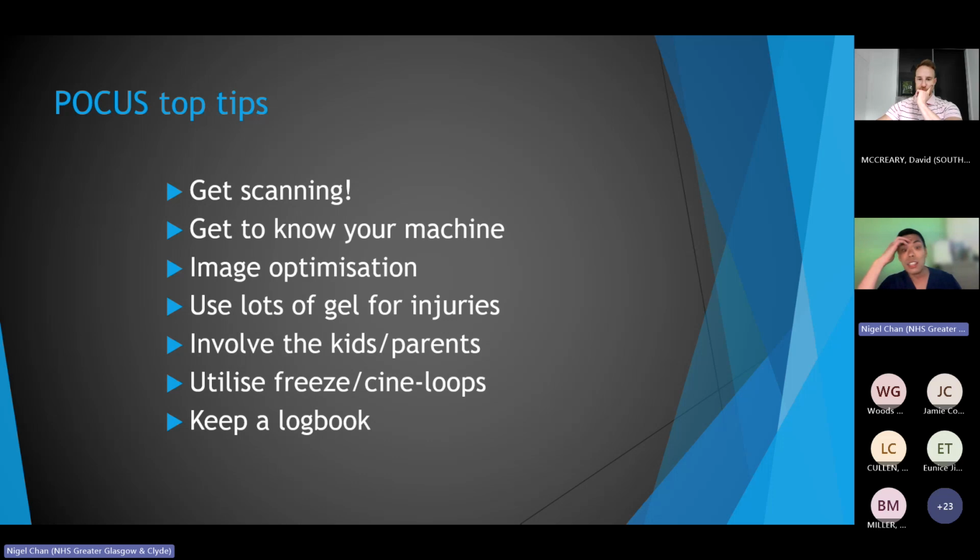And so these are my top tips. The first one is probably the most important, I think, for anyone who has either not done any scanning at all, or maybe you have come along to some of our talks but not done any scanning, or you've been on a one-day course a long time ago but then never did any more scanning. You've obviously hopefully gotten interested in it. I would encourage you to just find your machine and just scan patients.